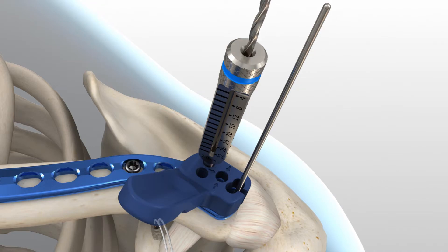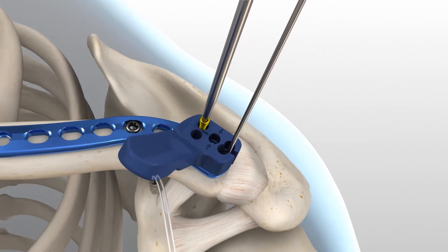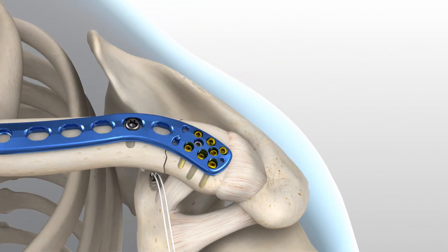Insert the 2.0 mm drill and advance to the desired depth. Drill depth is determined by referencing where the laser mark on the drill aligns with the measurement on the 2.0 mm locking drill guide. When between sizes, it is recommended to choose the shorter screw option. Remove the locking drill guide and insert the proper length of screw through the targeting guide. To insert the 2.3 mm locking screws into the threaded holes, use the 1.5 mm hex driver with a cruciform driver handle. Advance the screw until the screw head fully engages the plate. Repeat these steps until a minimum of six screws have been fully inserted into the plate and bone.